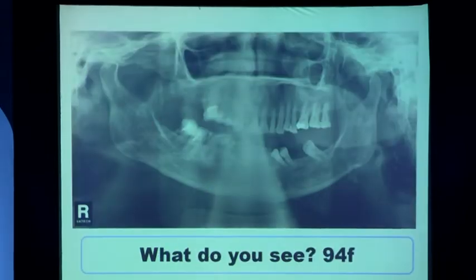Okay, this radiograph we already saw in one of the positional artifacts, right? There's an axial rotation of the patient. But what exactly is the variance in this patient? Condyle? Okay, there's a steep sigmoid notch. Very steep. This is one of the variations. What else?